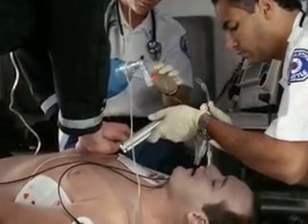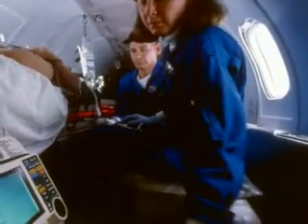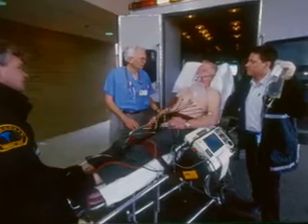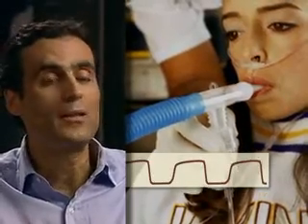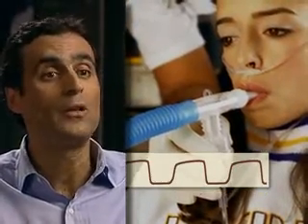There is no better way to document how your patient is breathing. With capnography built into your monitor, you can record the waveforms at any moment for the patient record. Successful intubation? Document it. Document continuous tube placement during transport and again on arrival at the ED. You can use capnography to document pre- and post-treatment changes, just like you'd use a rhythm strip to document pre- and post-changes when treating an arrhythmia. For example, an asthmatic: pre-treatment you'd expect a curved waveform characteristic of bronchospasm; after effective treatment — maybe one, two, three nebs — you would expect their waveform to revert to a normal rectangular appearance. Document that.